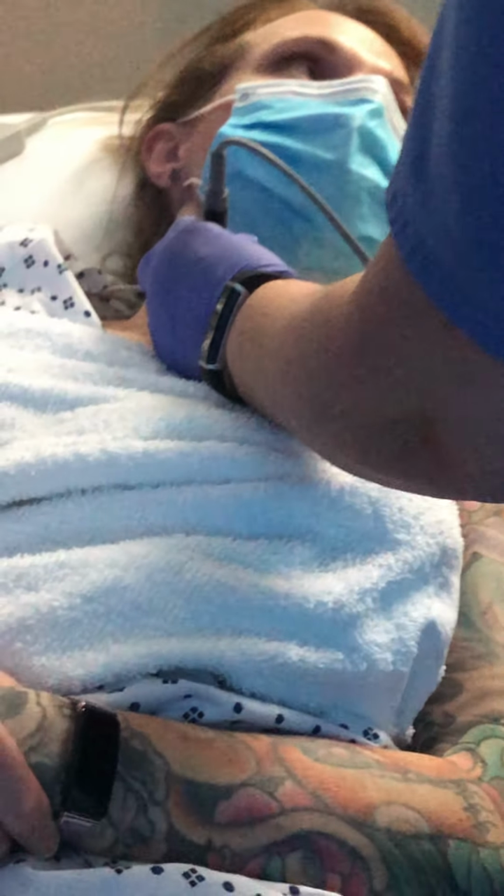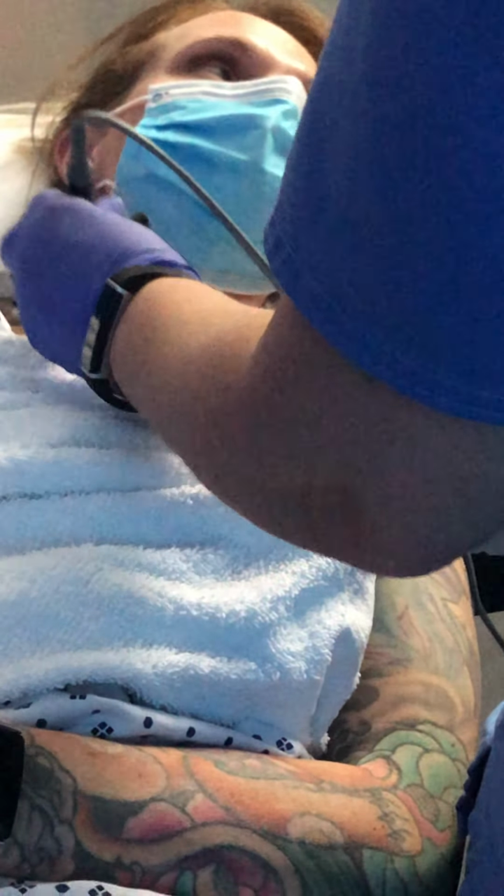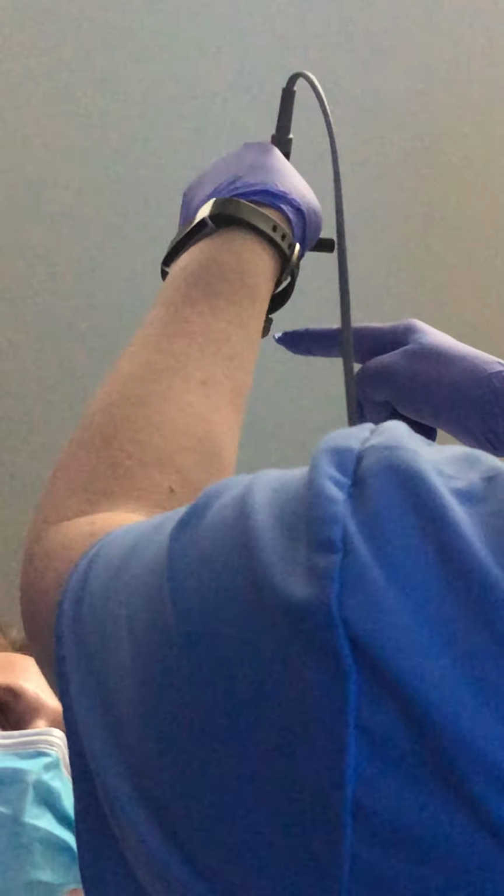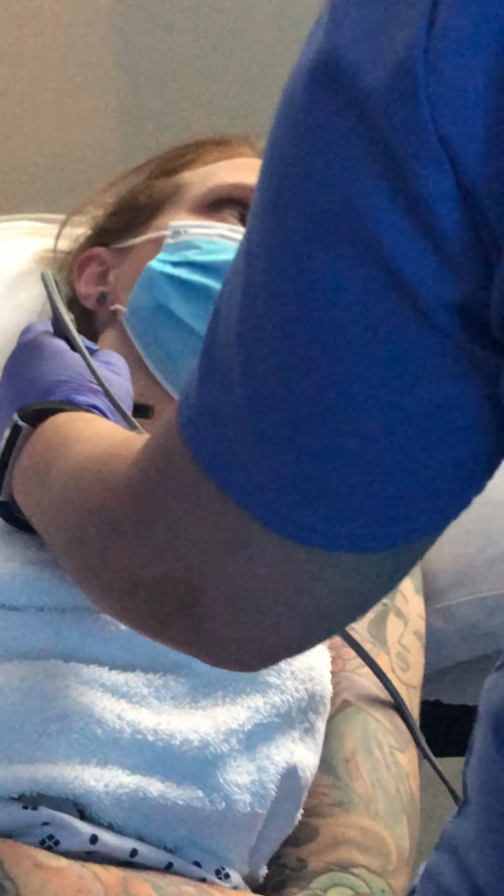Now I'm aiming towards my descending aorta. So I was like this now. This is my ascending and this is my descending. So I'm going to come back. Again, I like to put it off freeze here. I'm aiming towards the ascending aorta right here.